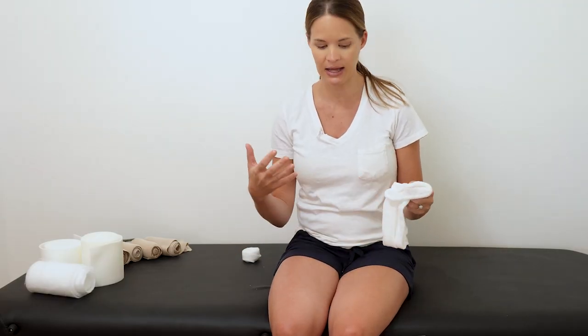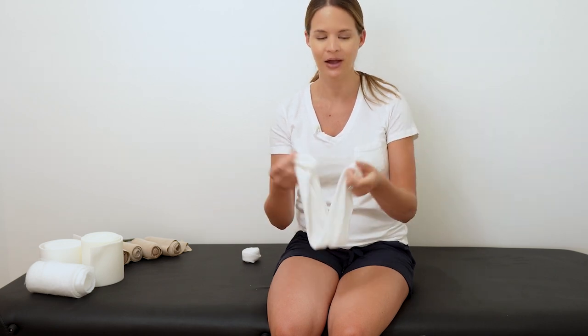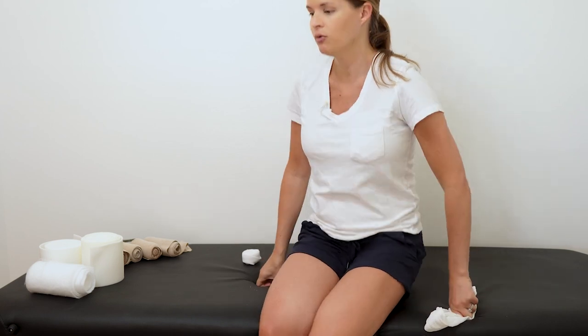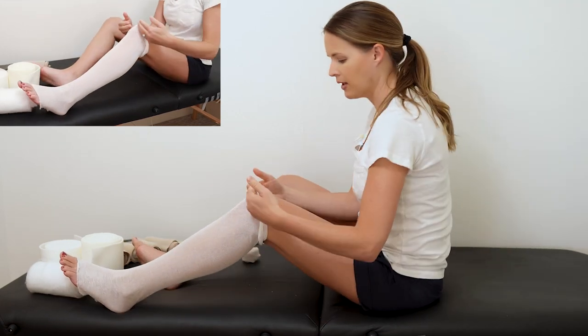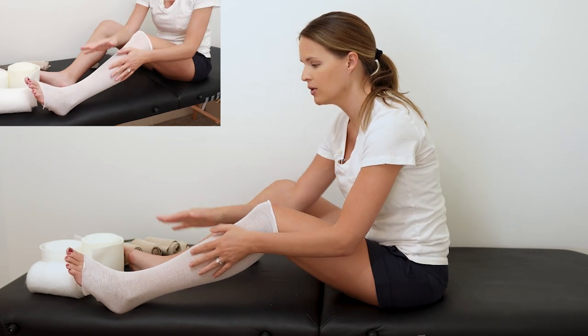The first thing we're going to do is put the stockinette on. Ideally someone's had a shower and has lotion on, making sure their skin is not dry and the lotion has fully dried. If someone is doing a full leg bandaging, they want stockinette to go all the way from the toes to the thigh. You want to have that skin covered with some sort of stockinette.